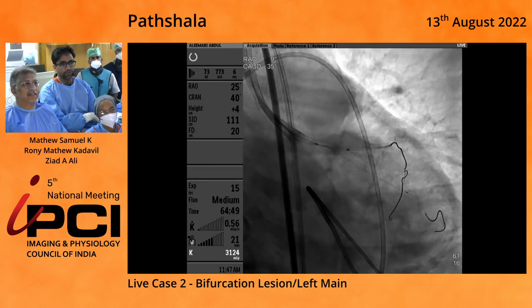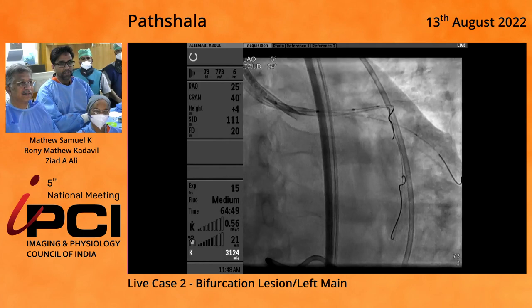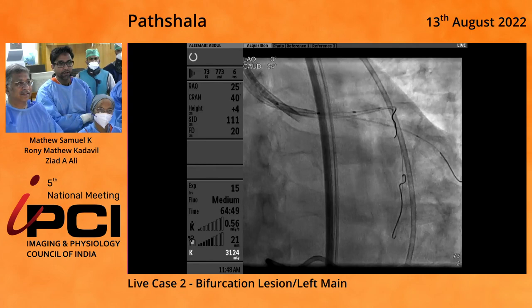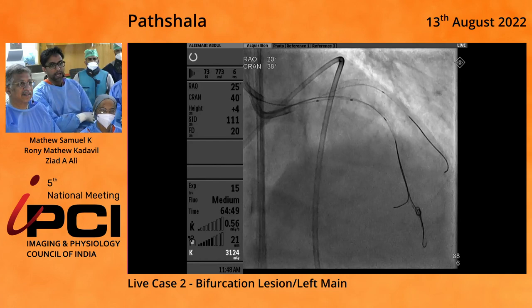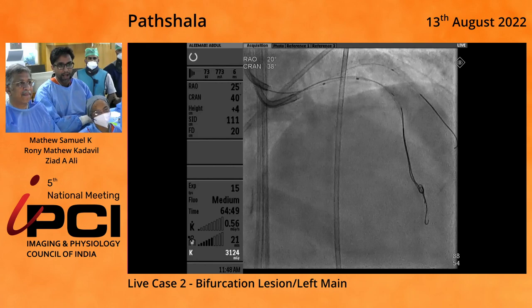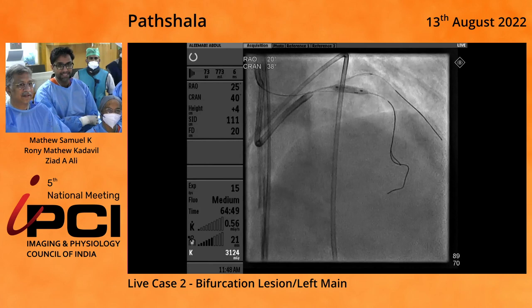You can see how many attempts we made. The Graftmaster won't go. What we've done is we've actually anchored a balloon. There's our kissing attempt again. Now what we did is we left all our wires in place to ensure we weren't behind a strut, and we rewired the LAD through the 8 French guide with a 360 wire.